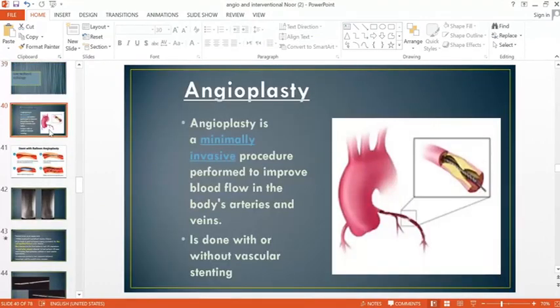We start by angioplasty. We mean by interventional radiology the procedures that the radiologist will do in order to overcome a stenosis or to opacify, to perform a therapeutic action on a vessel or an organ without the need for open surgical procedure.